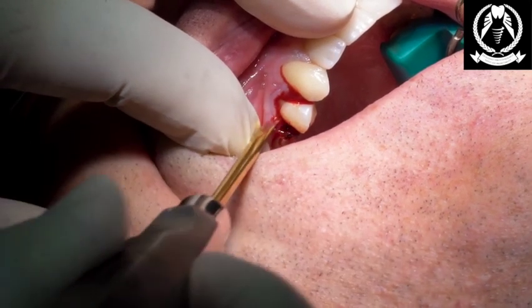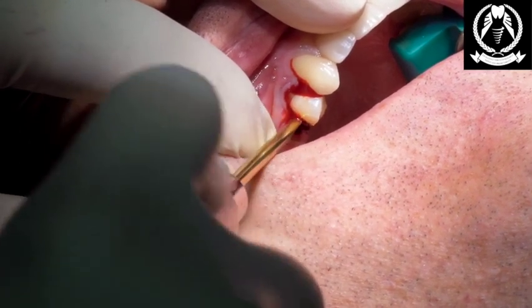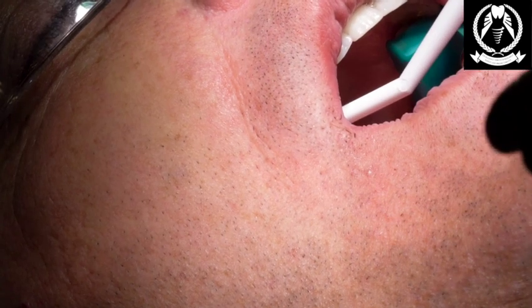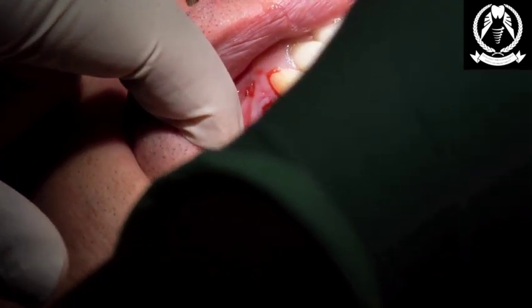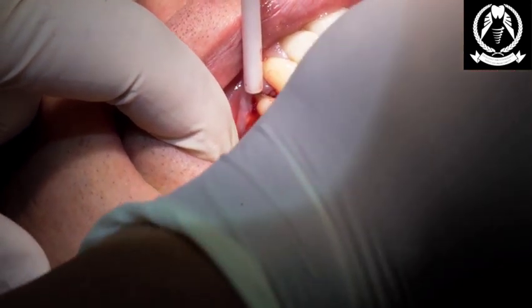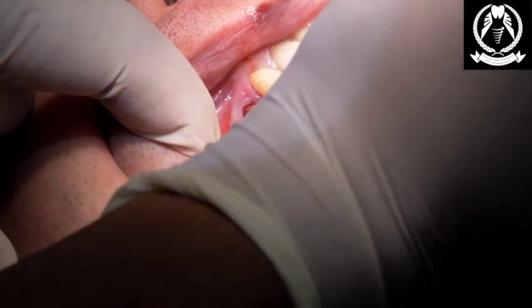That's awesome. So I'm still just leaning on that tooth, taking my time with that, just all from the buccal. Just clean that up. You can see a little fracture of the tooth there. Suction for me. Root forceps, please. Root forceps? Yeah, got it. Okay, sorry, just pull it down. Okay, so this is quite an infected site, so we're going to just deliver that. A little bit more manipulation.